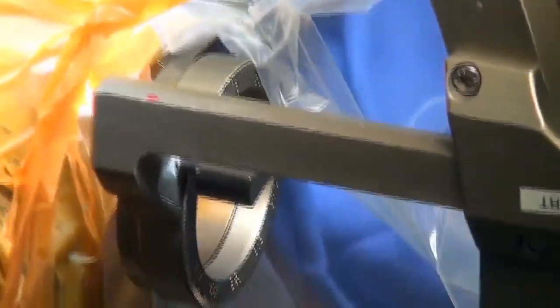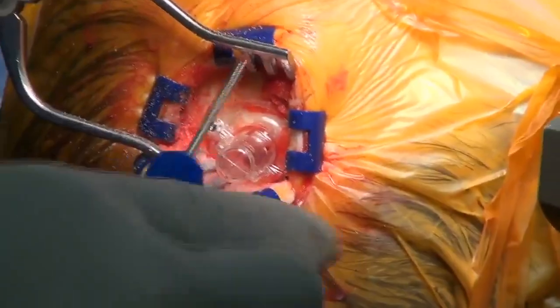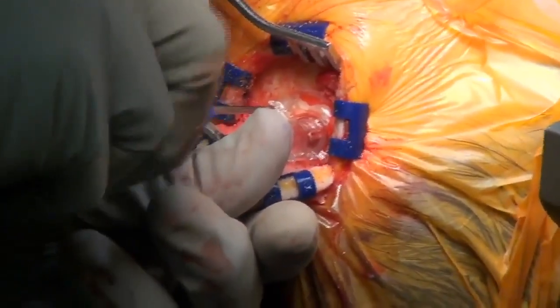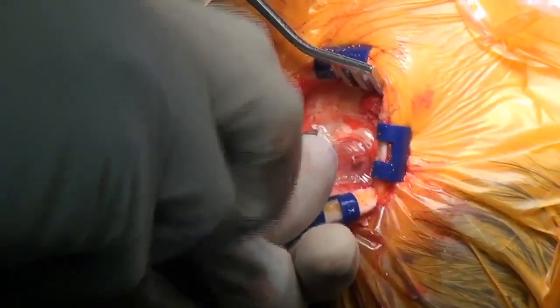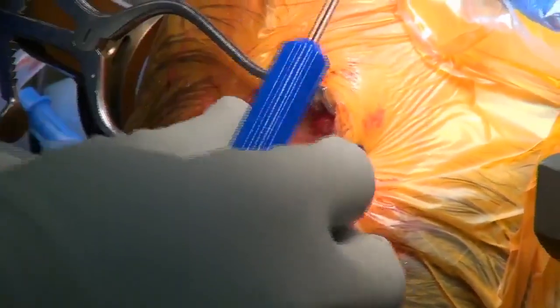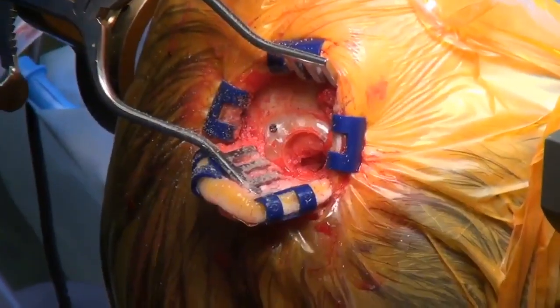So this is called the stim lock, and it's a device used so that once we have our wire where we want it to be, it doesn't move up and down, but if you squeeze the wire too tight, you can short it or break it and get open circuits. So this is designed to be kind of Goldilocks. Hold it not too loose, not too tight, but just right.